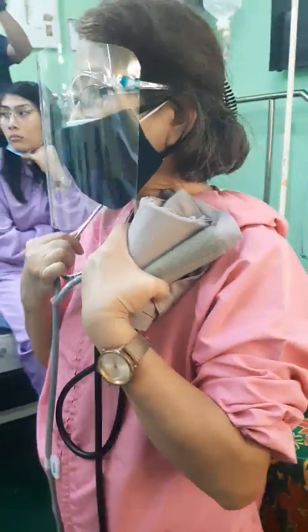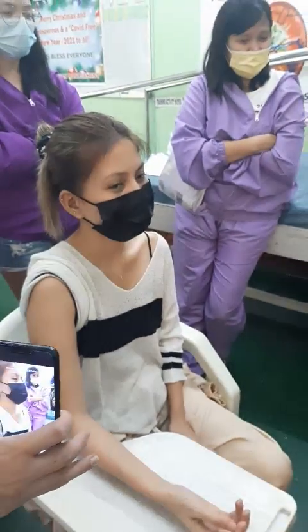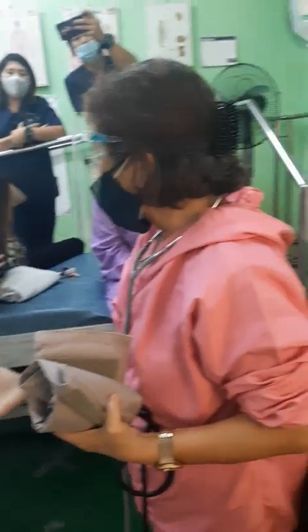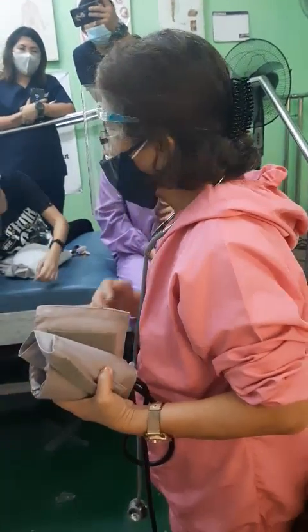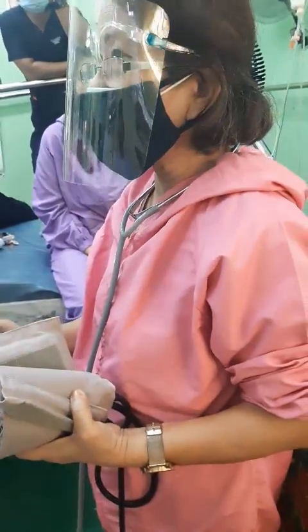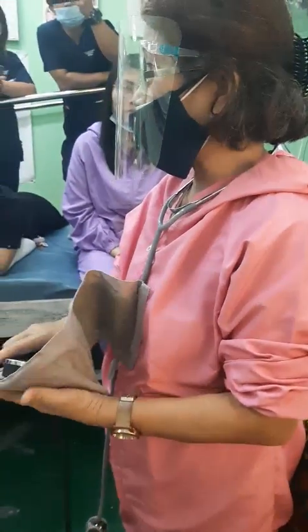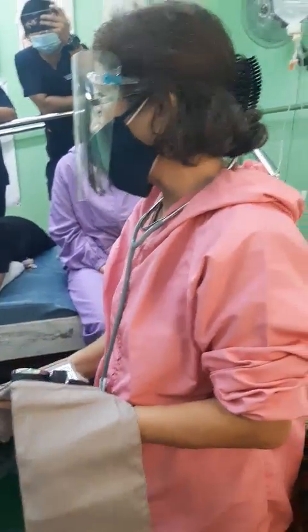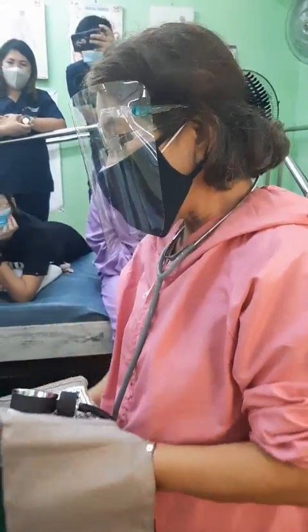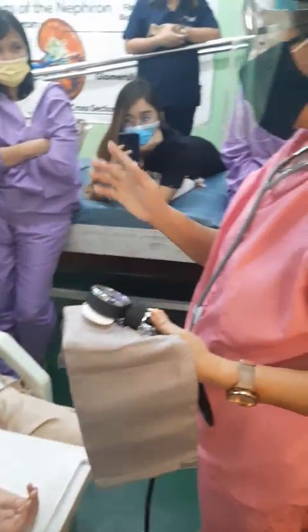Ma'am, if you have not been walking, I will take your blood pressure now. But if you have been walking, let her stand by and rest for five to ten minutes, then go back and get the BP. Why? Because activity will affect the blood pressure reading. Am I clear? Yes. So, keep rested.